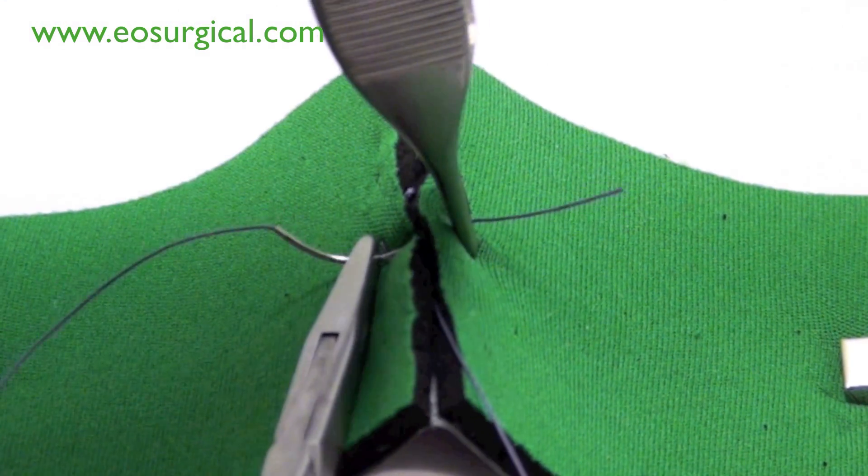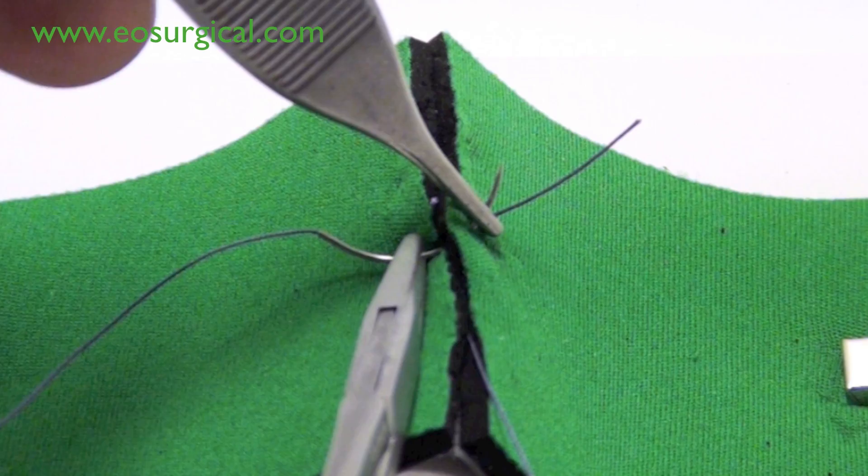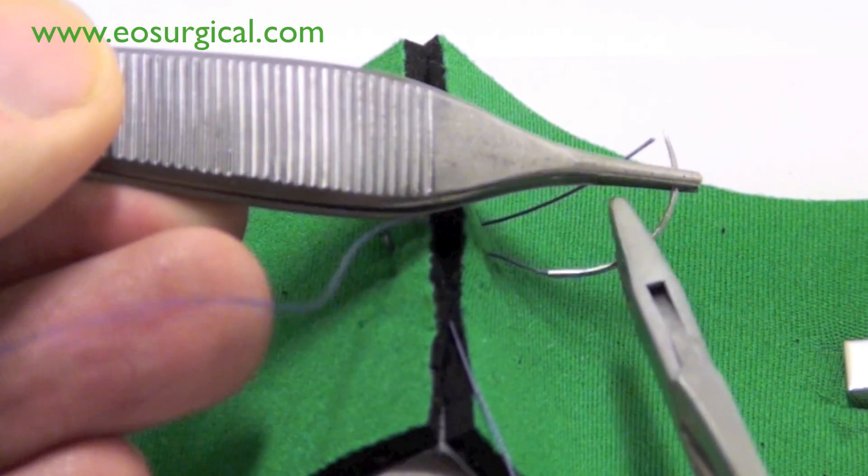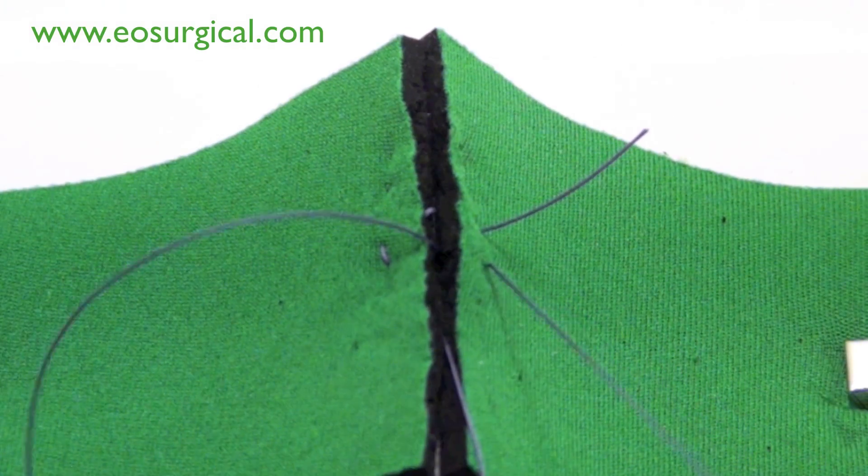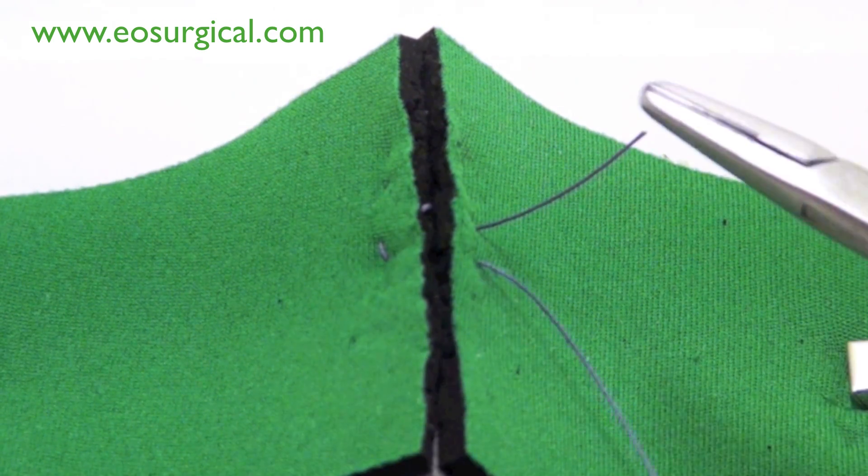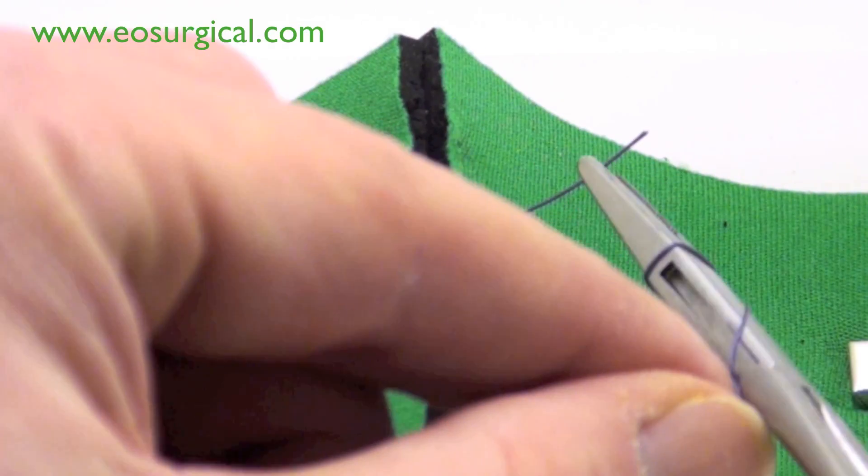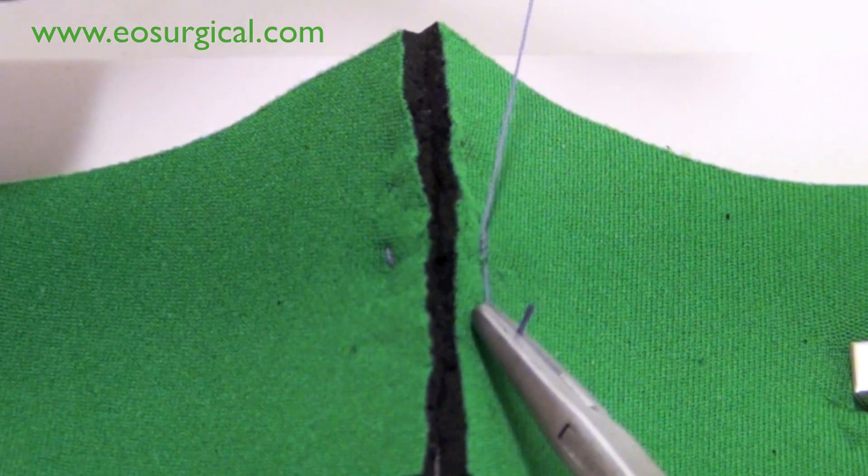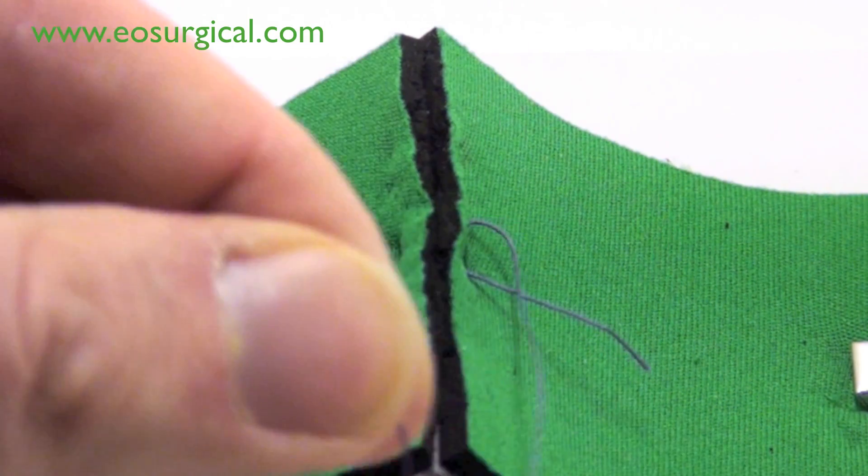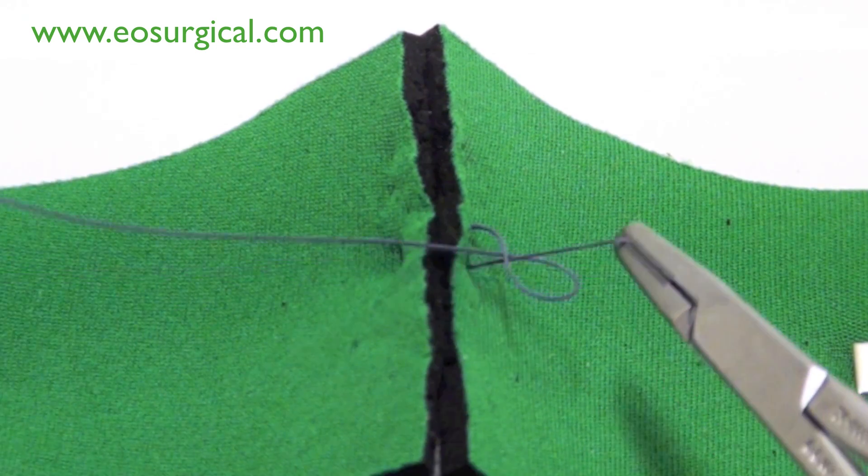The suture is now tied at this point. Now, you'll be able to see how the horizontal mattress causes the wound edges to evert up.